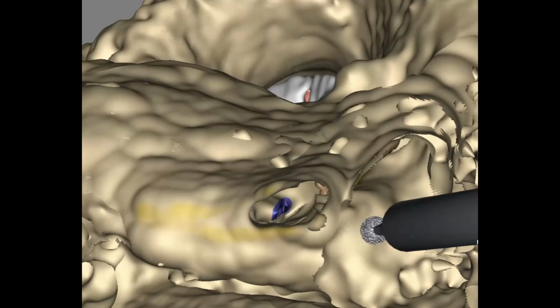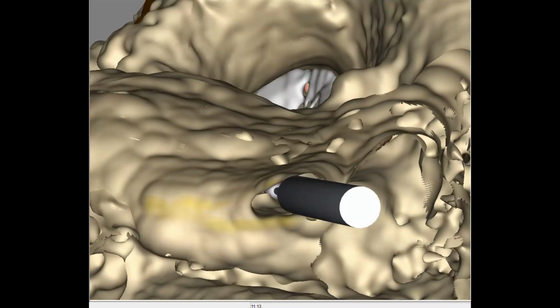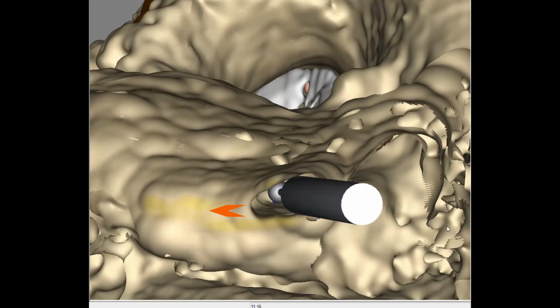Here, the tympanotomy has been completed, and we can see the round window niche. Once through, the tympanotomy can be widened, though this is limited by the narrowing to a V shape inferiorly as the chorda meets the facial nerve trunk.